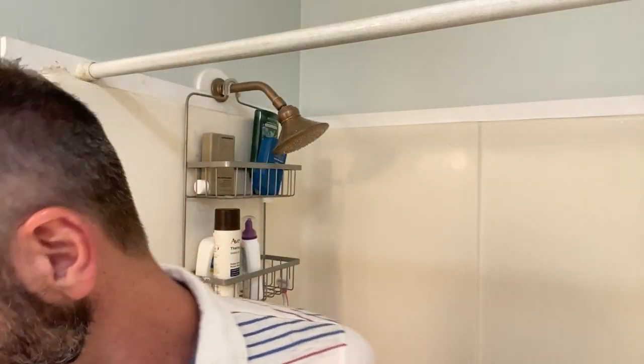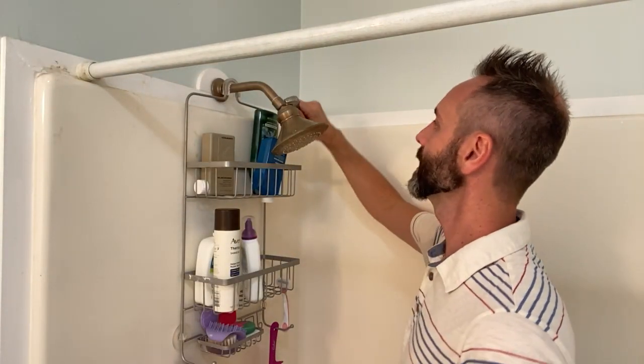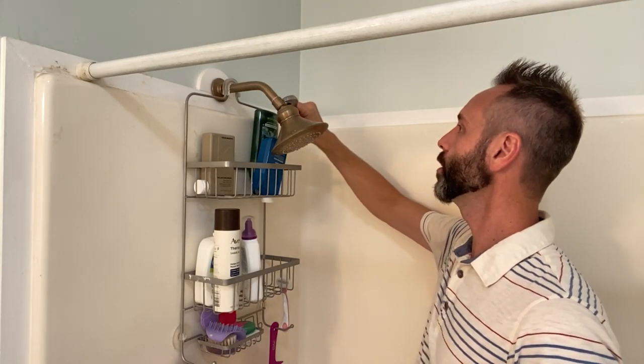The only tool you're going to need is a crescent wrench to get your shower head off and to put the new valve on. They also give you teflon tape, which you'll want to use so that you don't create any leaks.